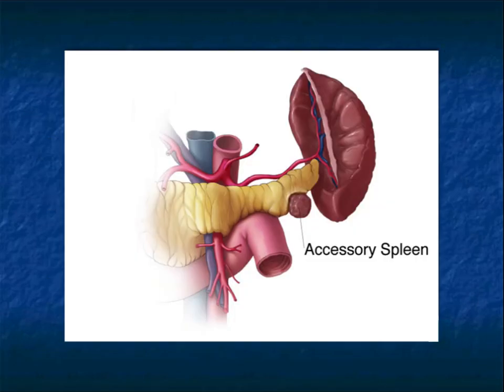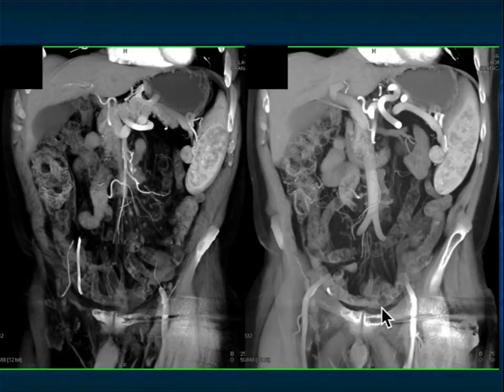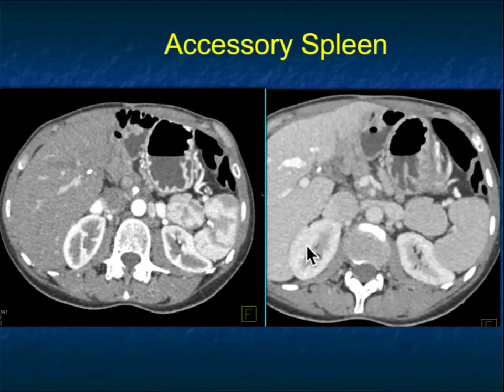Here's a schematic of accessory spleens: in coronal view they are more common on the inferior surface of the spleen, which can help distinguish them from neuroendocrine tumors. One example shows a three centimeter mass near the splenic hilum with a moray pattern on arterial phase that looks identical on venous phase — very classic. Neuroendocrine tumors of the pancreas will also be bright but won't match splenic enhancement on both arterial and venous phases.